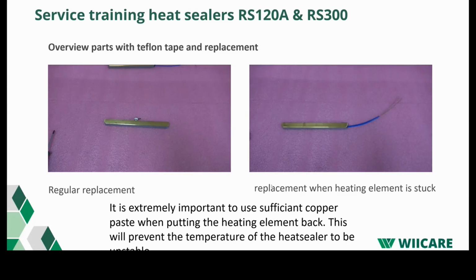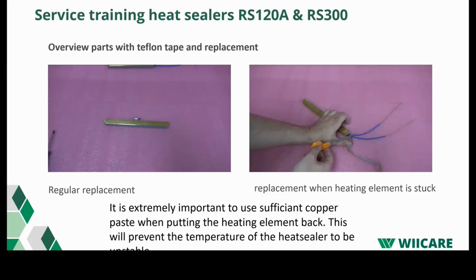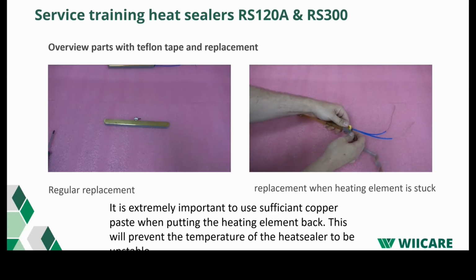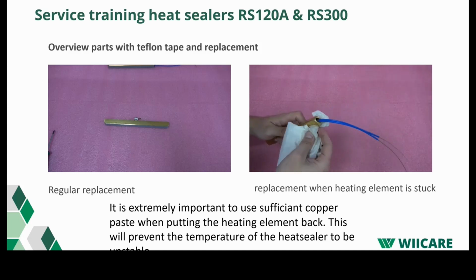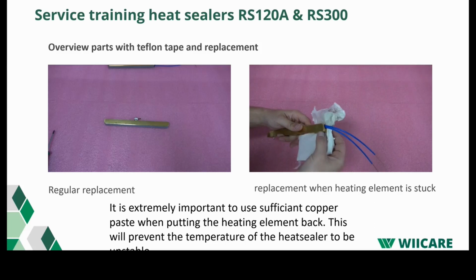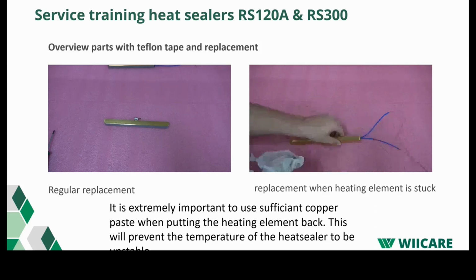In case you got a heating element that you cannot remove, you can do the following. Remove the old tape. And clean the surface with a degreaser. Apply the new tape.